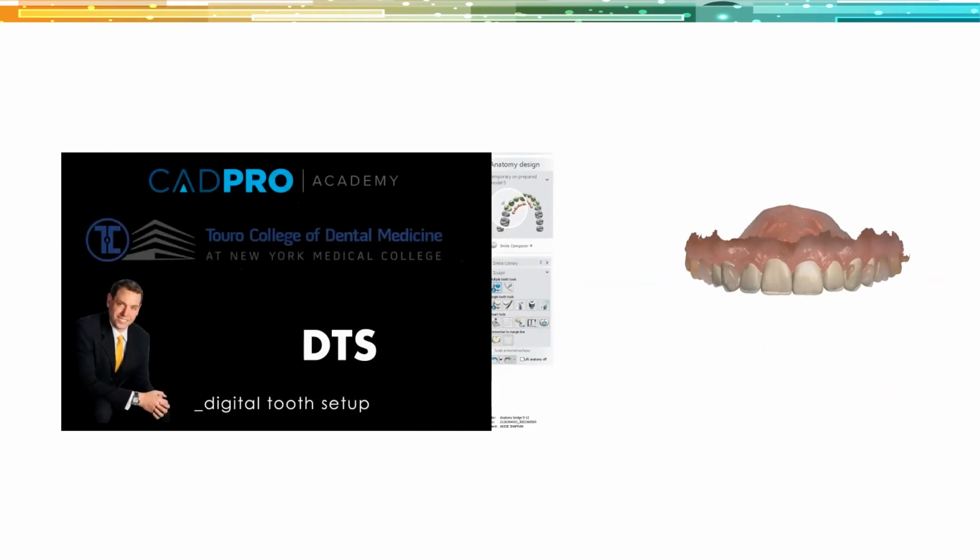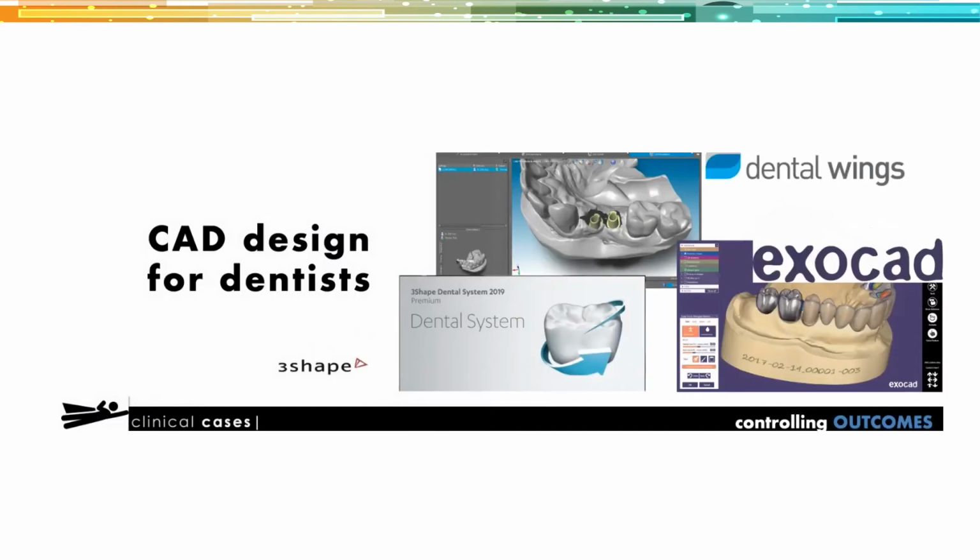yourself. And so we teach at Touro College of Dental Medicine, and my teaching partner, Dr. Alan Jerm, he came up with this term DTS. It's a digital tooth setup. So every case starts with a DTS. And now is when you get that CAD design software that we were talking about at the very beginning. And we happen to use the 3Shape product.